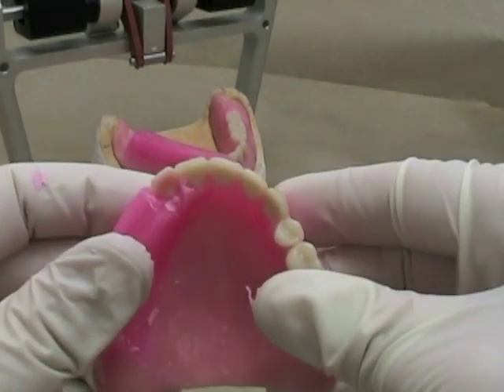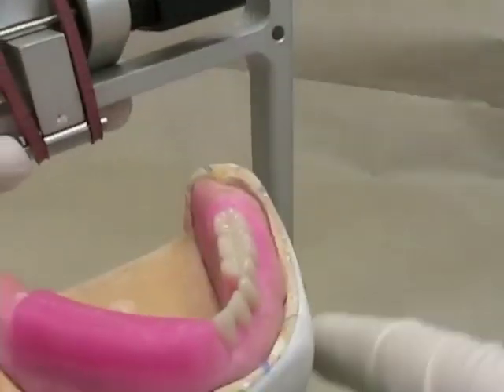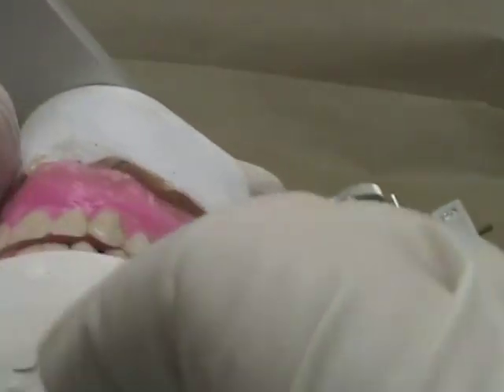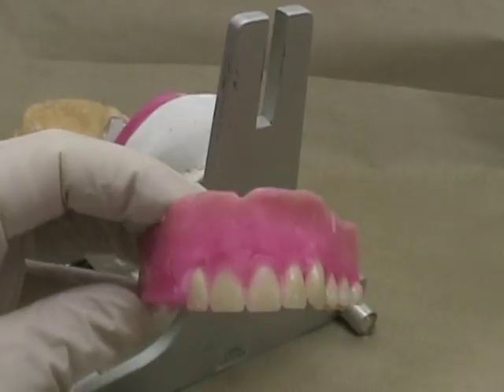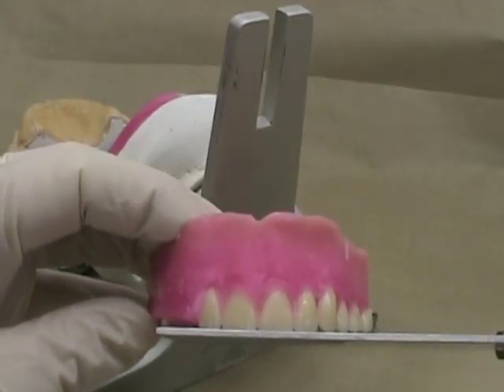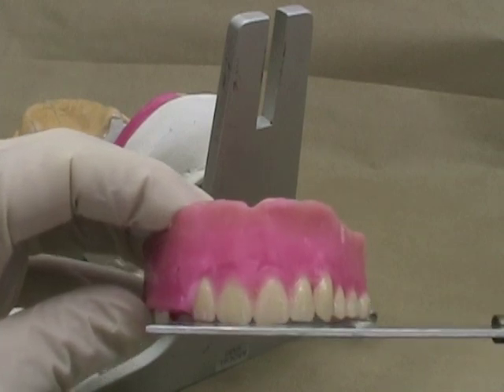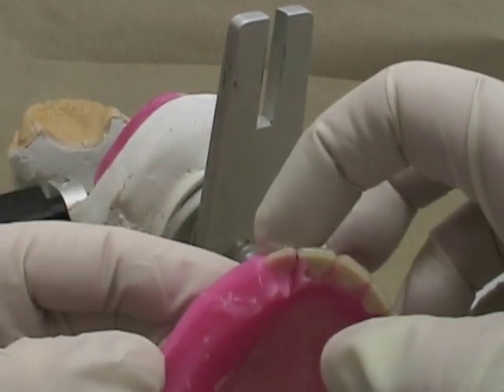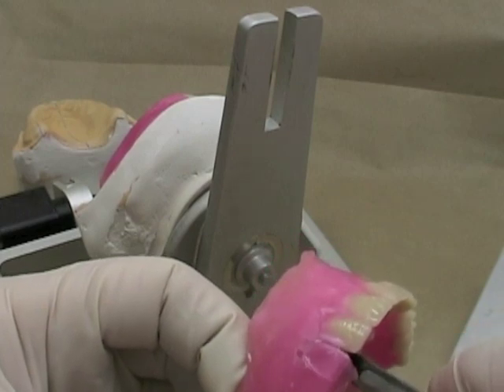Don't forget to put it back on your articulator and check your overjet with the adjacent tooth, and also on the opposite side to confirm you're getting about the same amount of overjet from side to side. You can use a straight edge to verify that your lateral incisor is slightly above the edge of the central incisor. Make sure that the neck is not too prominent.